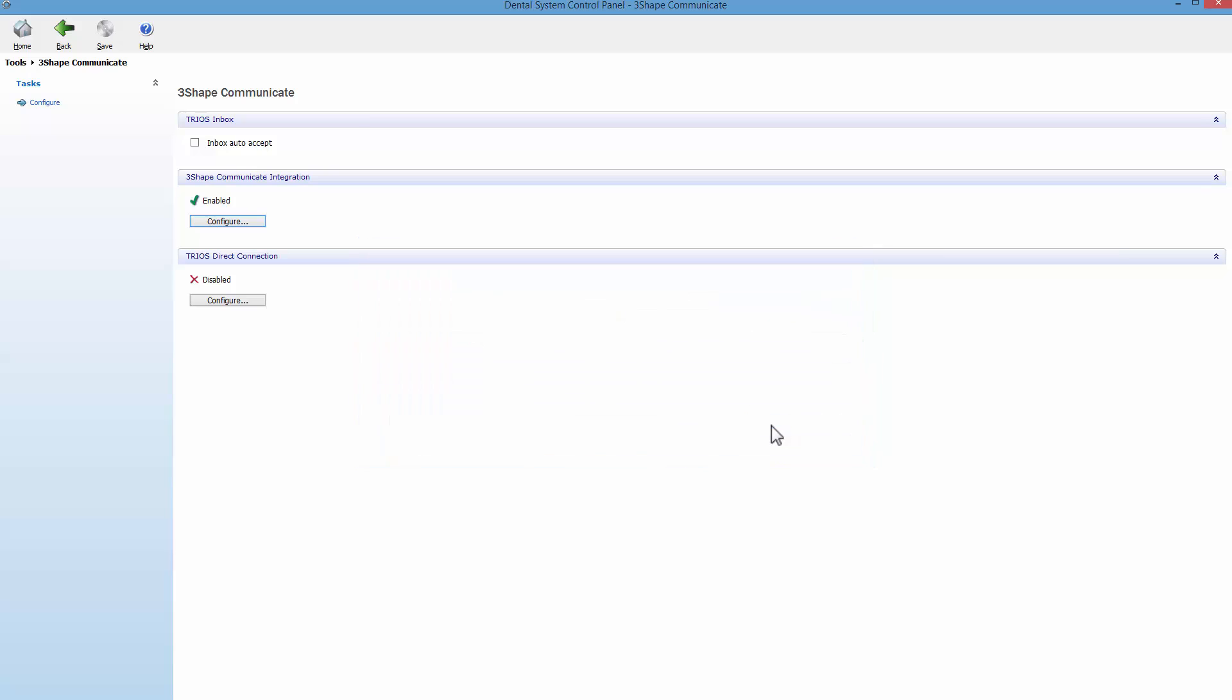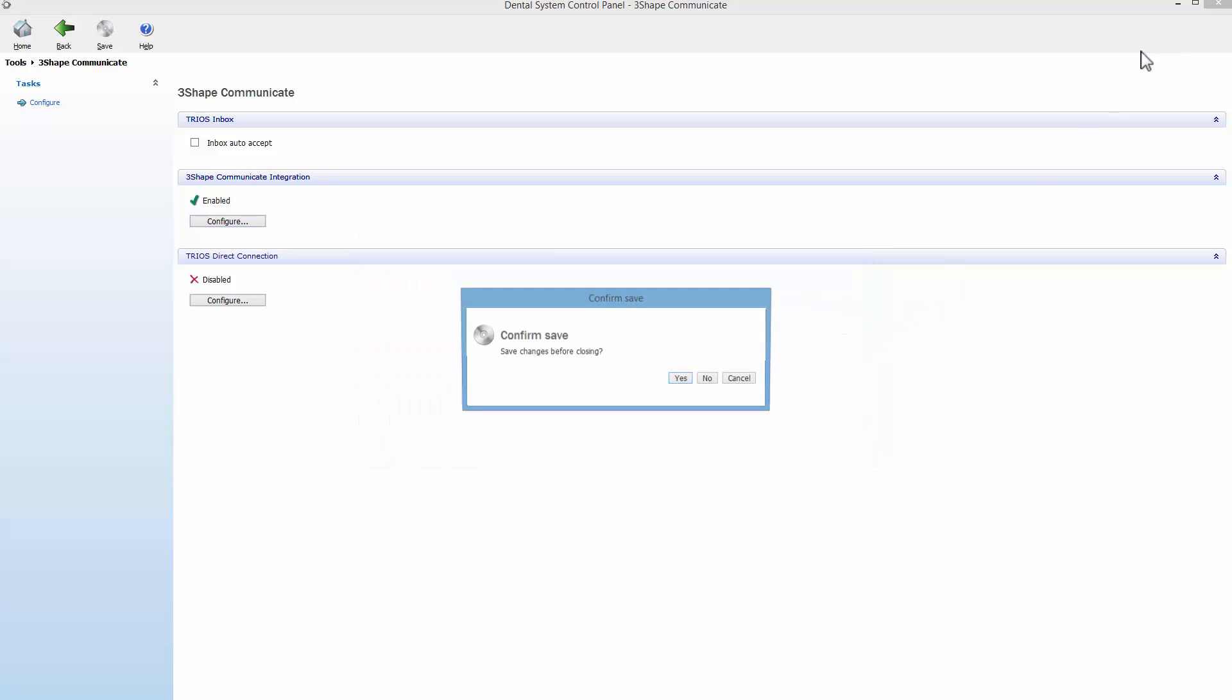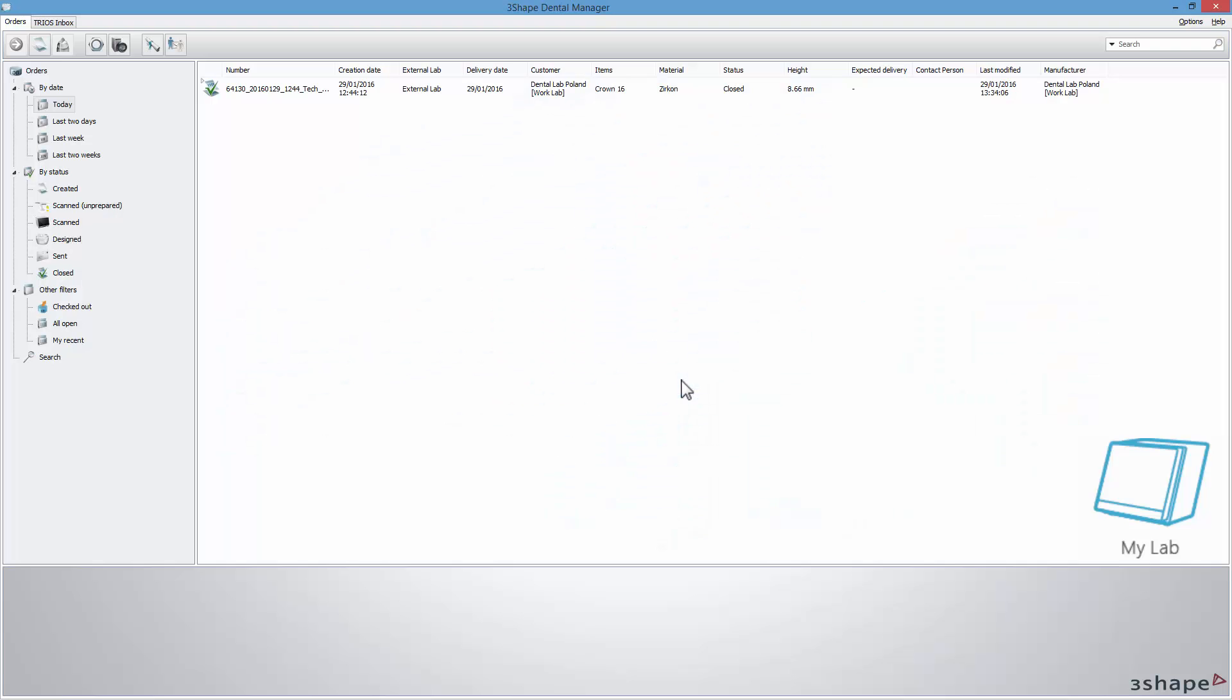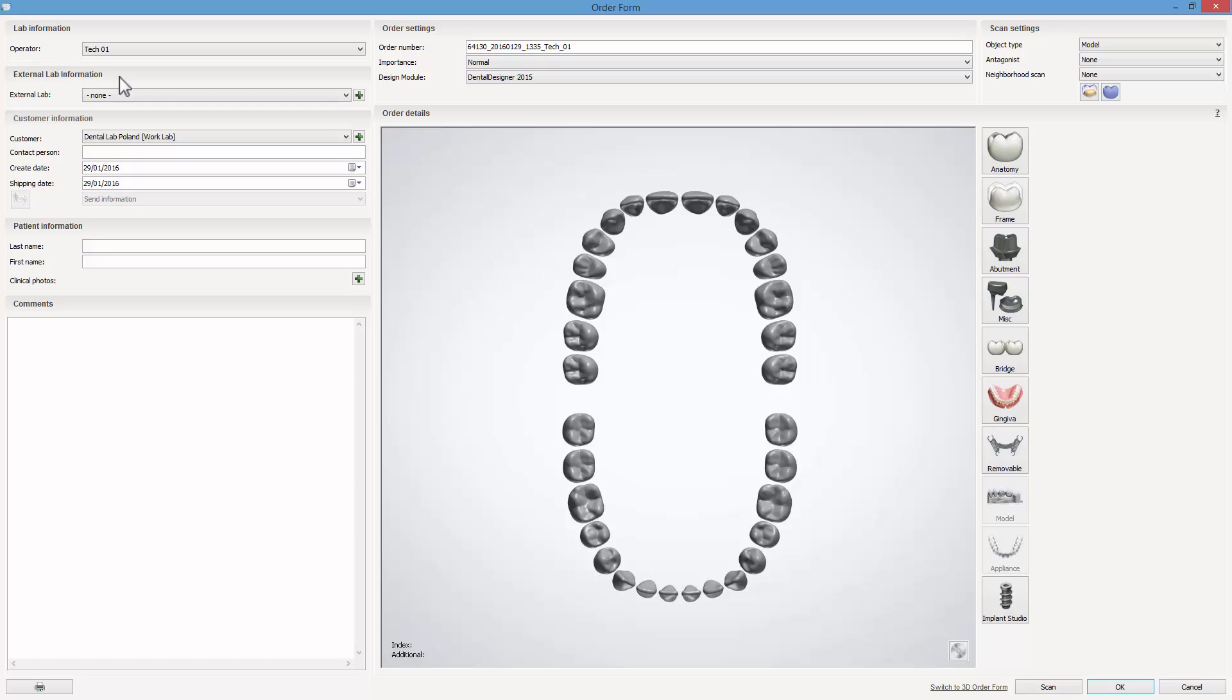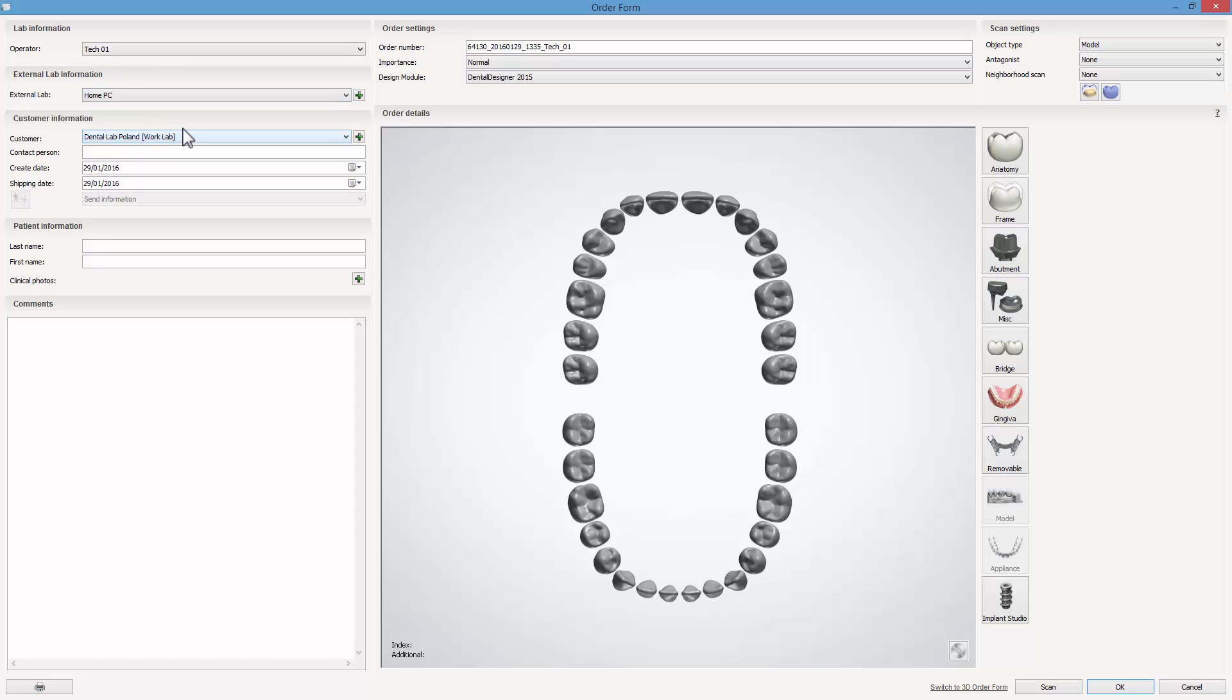Also keep in mind that if you have only one dongle, you need to take it home with you to be able to work with the dental system. Open the order form and now select your home PC or other workplace in the external lab information menu.